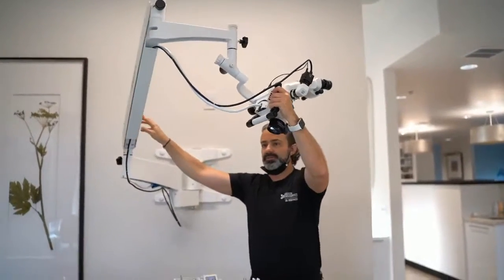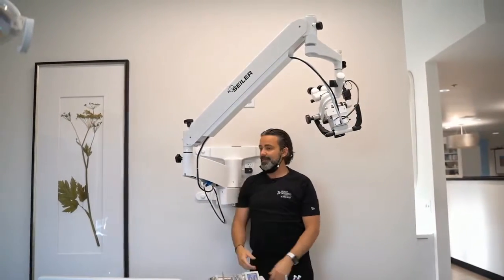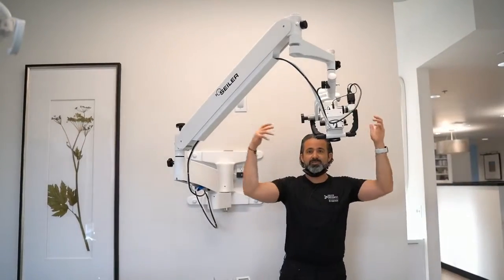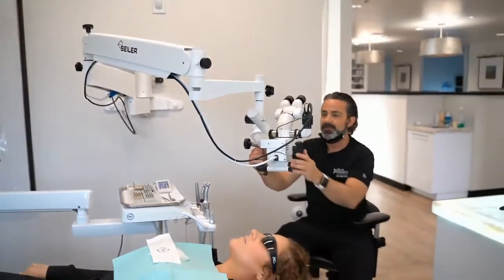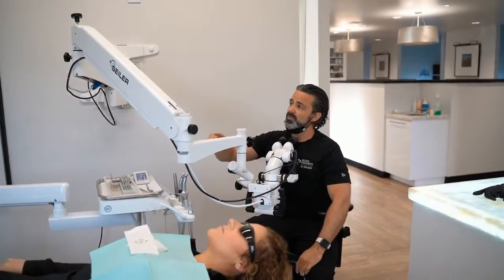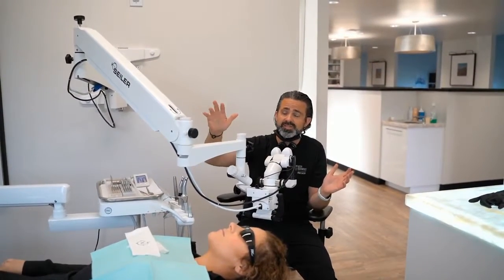I can turn it so, let's see, I'm looking at your image here. I'm 5'9", and I'm mounting this just at ear level, I guess. And when I go like this, I have no problem standing around it. And I have no problem at that same height sitting and bringing it down. In fact, I could even come down and move the microscope right below my chin. So this arm length boom is something that I really like as far as working around patients in the room.